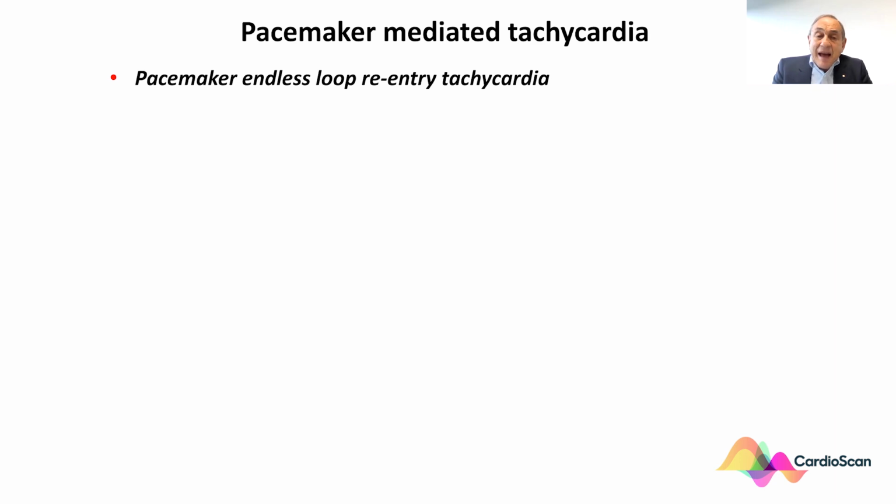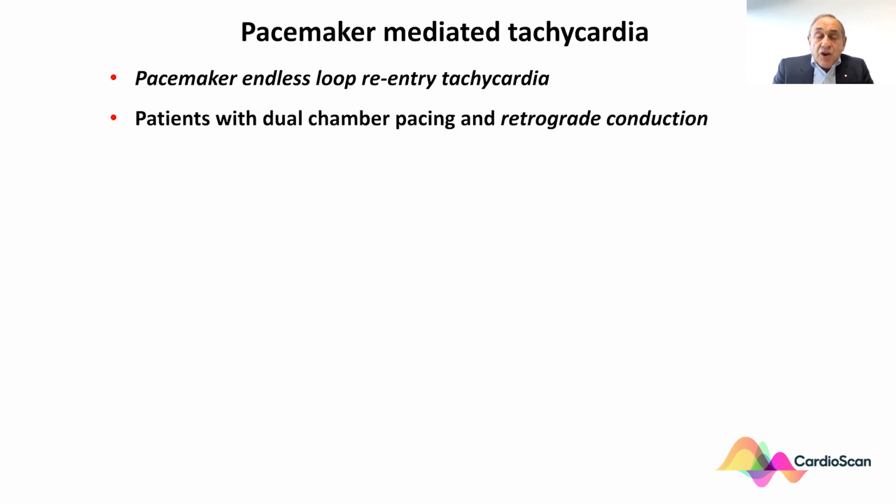This is a pacemaker endless loop re-entry tachycardia. It occurs with patients with dual chamber pacemakers and having retained retrograde conduction.